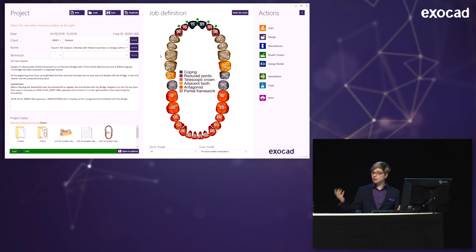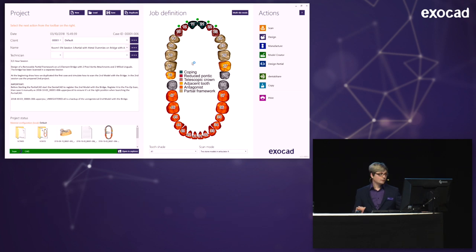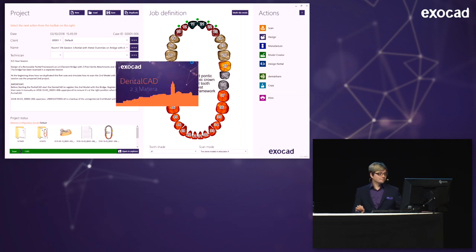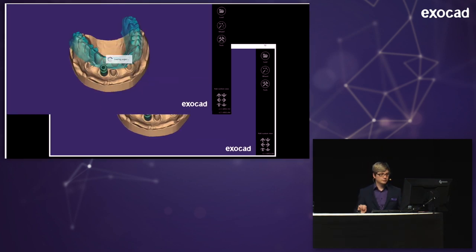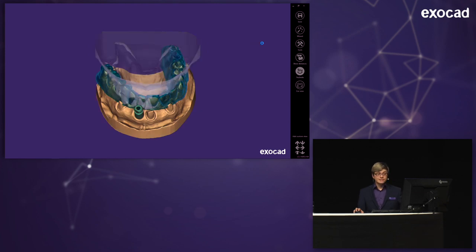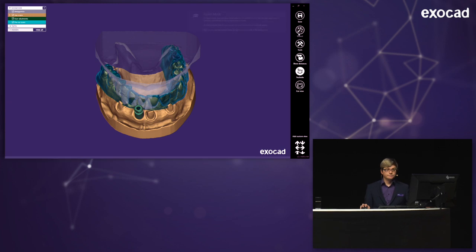So the trick for that is just scan the model with the bridge, as we did in this case, and you will see what to do then. And I'm again using the same case, just hitting design. So you may have realized it's actually not exactly the same case, to be honest. We copied the complete case just for this demonstration, but it's all the same files, so it works this way. So it starts the same way, obviously, because it's the same case. But I'm just switching to expert mode.